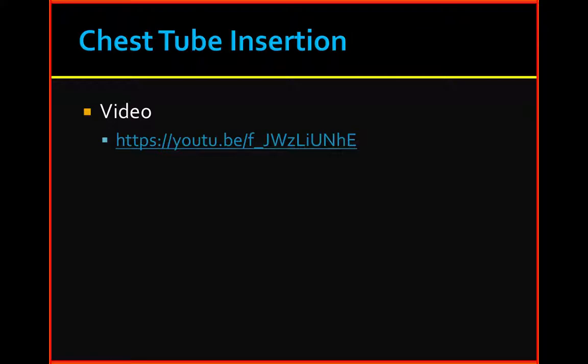A radio-opaque stripe runs along the length of the tube and out. So there's a white line. It's hard to see here. Radio opaque. You'll be able to see that on X-ray. What's interesting is the last hole is always put in the middle of that, so you can see the break.